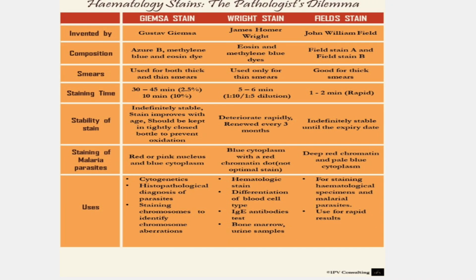Now these are the other stains: Romanowsky stains, Giemsa stains, Wright stains and the Field stains. For our purpose, we actually just need to know the names of these stains, and I have given details of their activity.